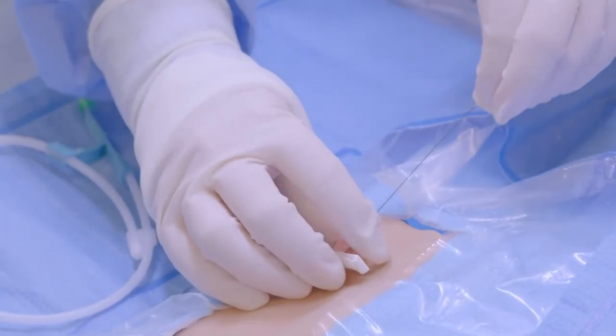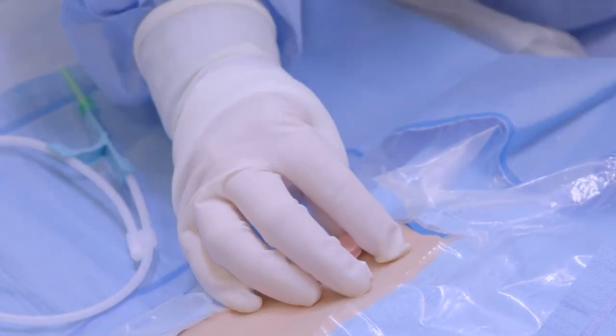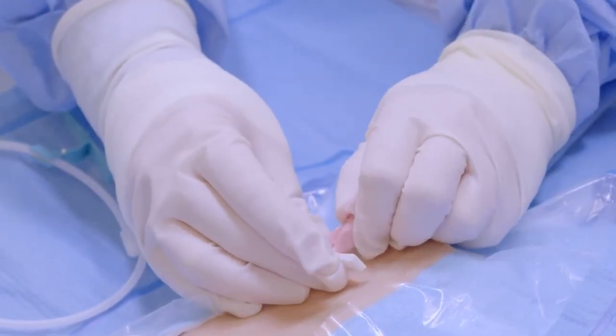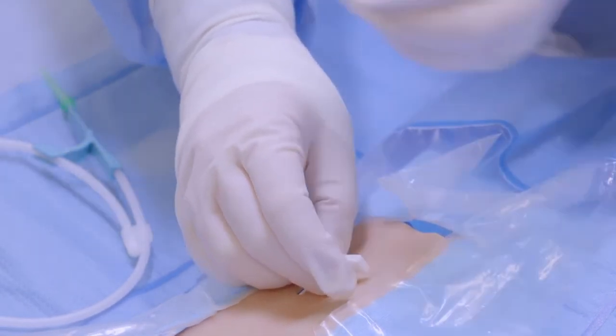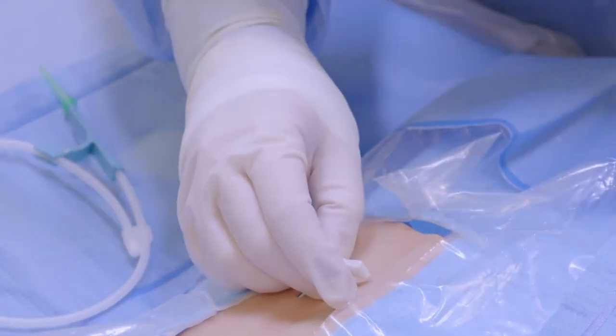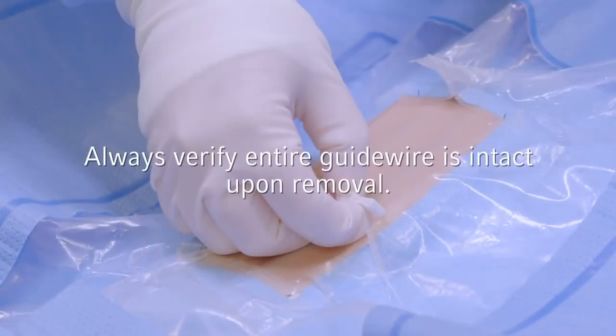Check sheath placement by holding sheath in place, twisting dilator hub counterclockwise to release dilator hub from sheath hub. Withdraw guide wire and dilator sufficiently to allow blood flow. Be sure to quickly place finger or thumb over sheath end upon removal of dilator and guide wire to reduce risk of air entry. Always verify entire guide wire is intact upon removal.